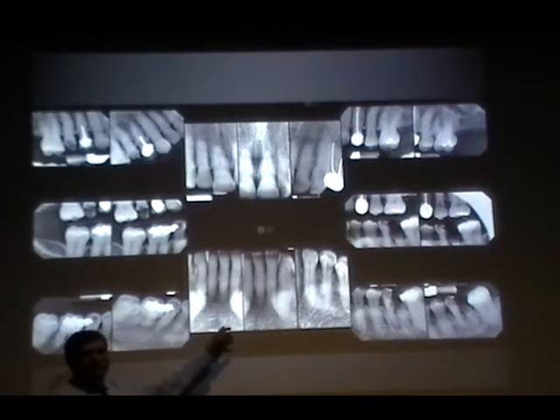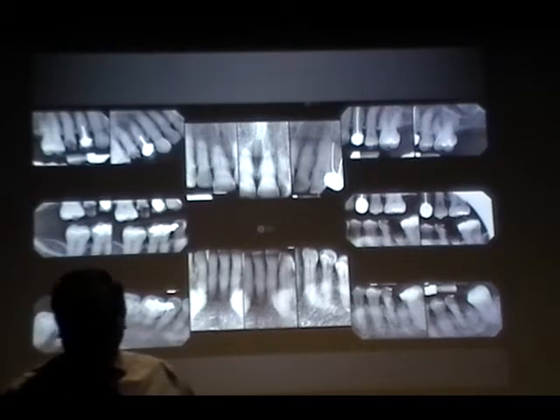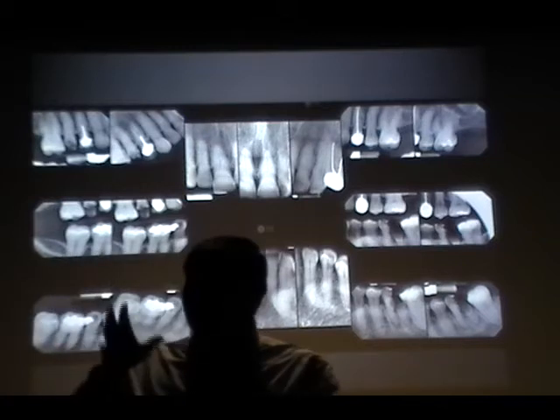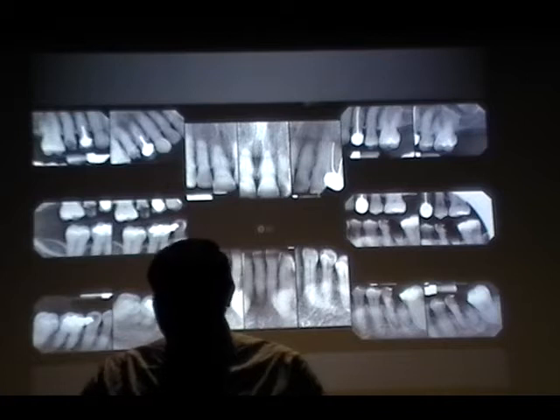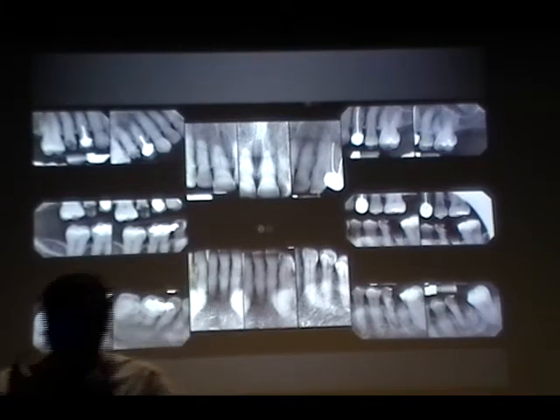I was on the other one. Yeah. One thing that you forgot to mention, or you missed, is that it's a lateral incisor view. We want to focus again on the lateral and canine. So if you place the white block between those two, you'll get it. That's it. Again, placement is very, very, very important.